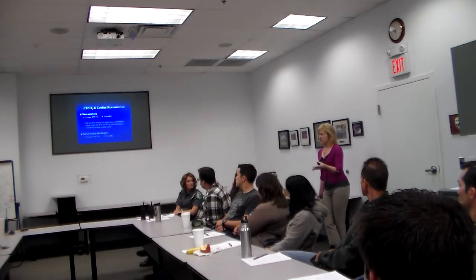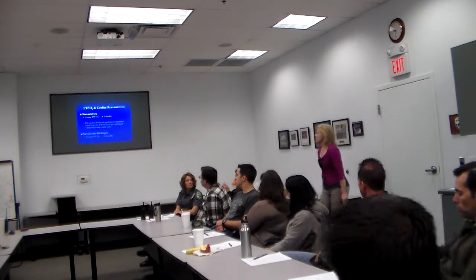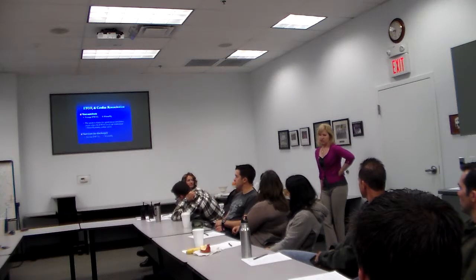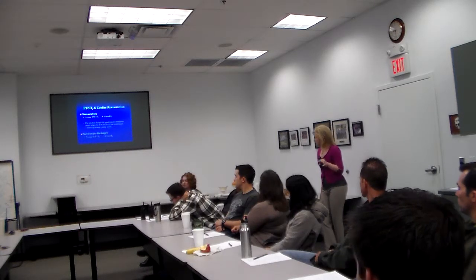You just knew you were ventilating your patient effectively, using your end-tidal CO2, and we called it within like 5 minutes after the patient got there because this patient wasn't going to survive and he had been down way too long. But I just wanted to share that because it was a really, really good call. And with the AutoPulse, if you don't have a battery issue with your AutoPulse that day, I think we kind of solved that problem, huh? The AutoPulse gives great compressions, and so you get good numbers, if you're going to get them, with your end-tidal CO2. So just keep that in mind.